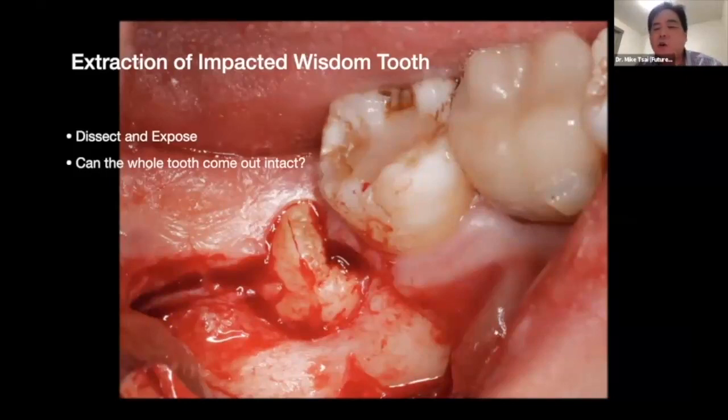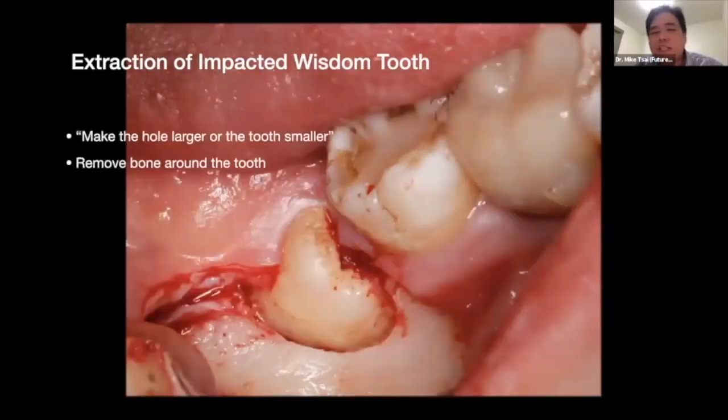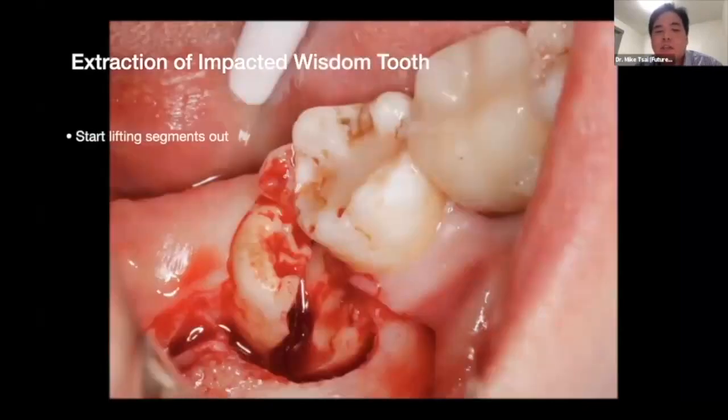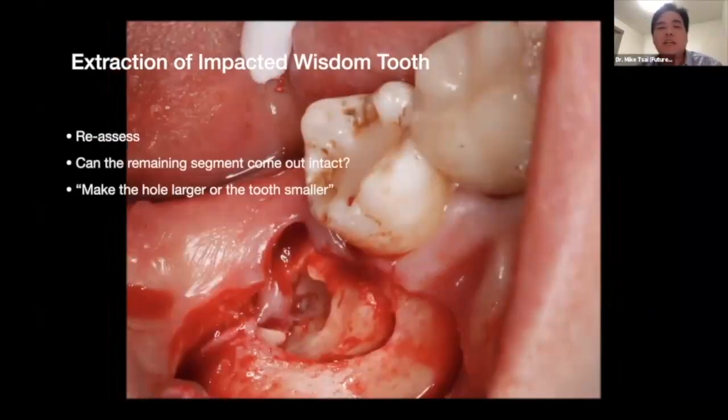So now the question becomes, when you have the flap like this, can that tooth come out? Can that tooth come out intact? What do you guys think? The general mantra of taking out a wisdom tooth is making the hole larger or the tooth smaller. Remove the bone around the tooth, that's the first thing I'll do. Cut the tooth into smaller segments, right? We divide it and start lifting the segments out. We reassess. Can the remaining segment come out intact? What do you guys think?